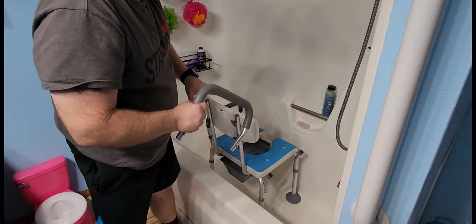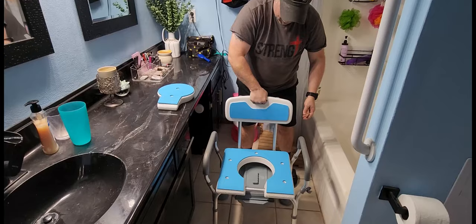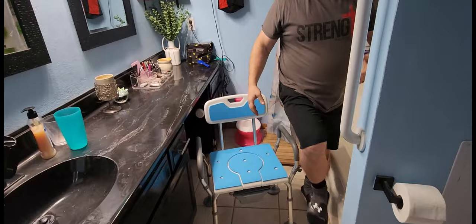The chair weighs about 17 pounds. You can pick it up from the armrests or use the handle provided in the back. It's really easy to move around and pretty convenient. It has non-slip feet, so you're going to be pretty safe, and again it holds about 400 pounds.